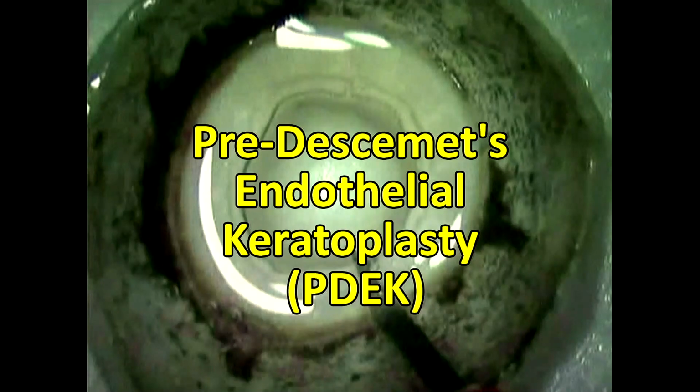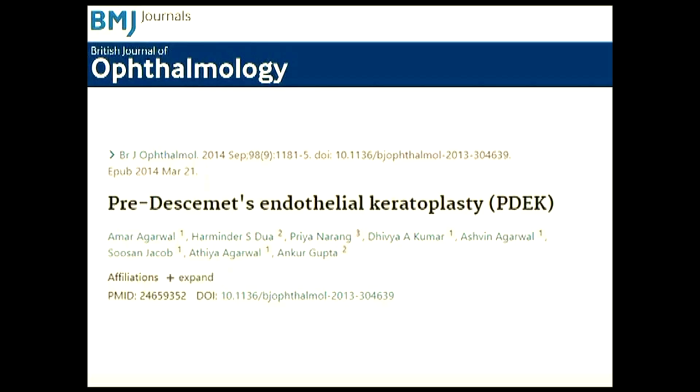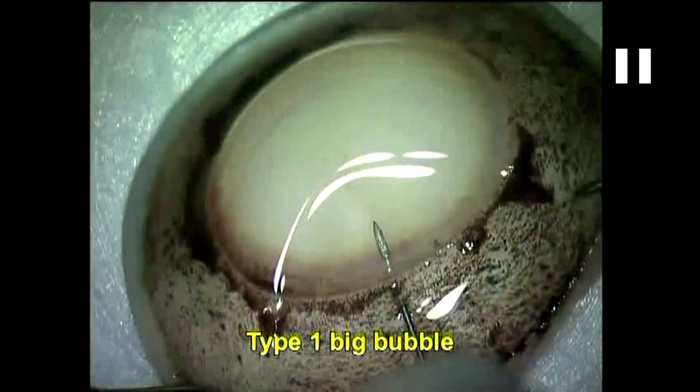Thank you very much, Dr. Ashwin. Such a pleasure to have Eric also here with us. So let's talk on pre-Descemet's endothelial keratoplasty. So this is PDEK, which we first started with Professor Harminder Dua.